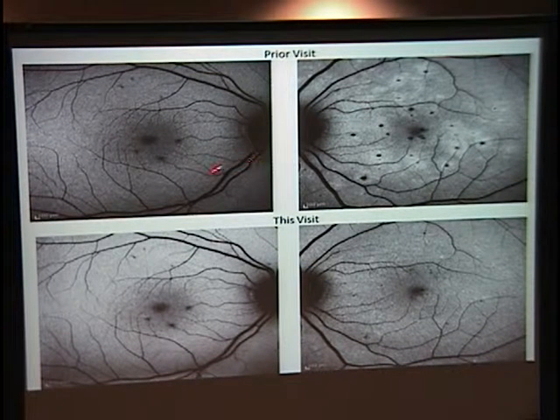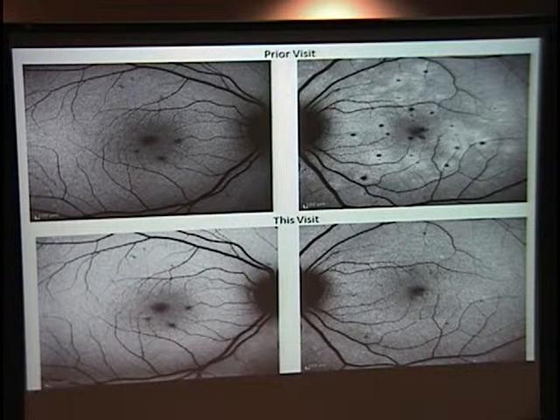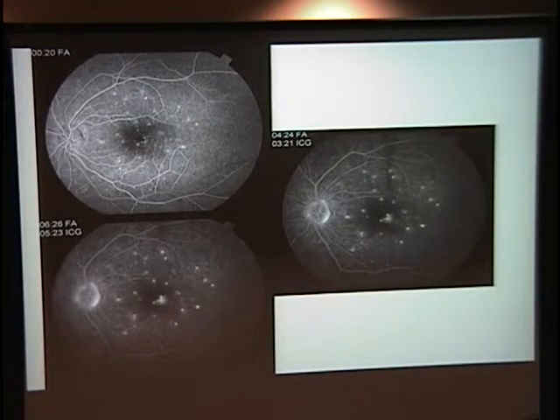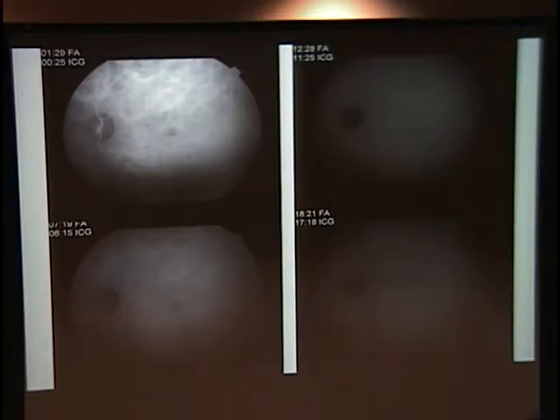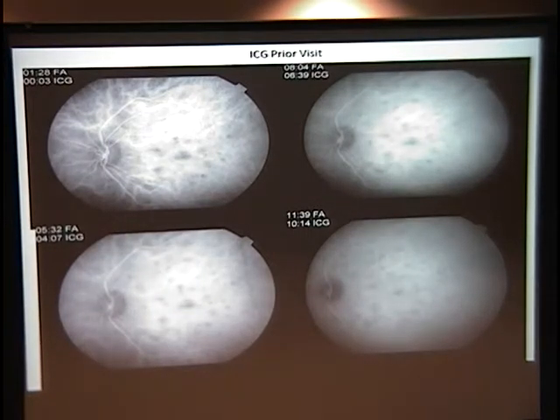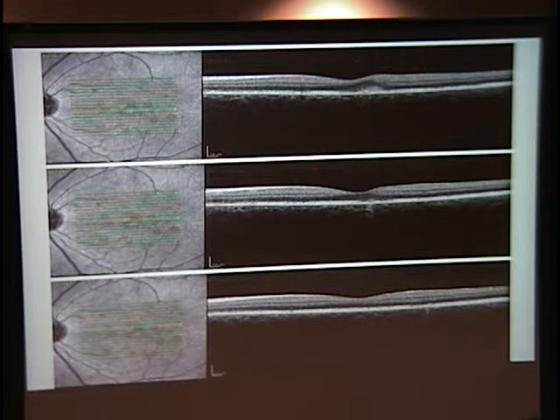And on the fundus autofluorescence, you probably see the most impressive documentation of that. You can see just how that hyper and hypo autofluorescence has improved dramatically there with the oral steroids in the left eye. The right eye really has remained the same. At this point, though, when we look at her fluorescein angiogram in the left eye, here's early, and here she has this continued hyperfluorescence that seems to expand a little bit centrally there. ICG really is, I think, impressive in the left eye, how much better it looks. So here it is today, and here it was the visit before. So quite an improvement on those hypofluorescent spots. OCT stable in the right eye again, and much improved in the left eye.